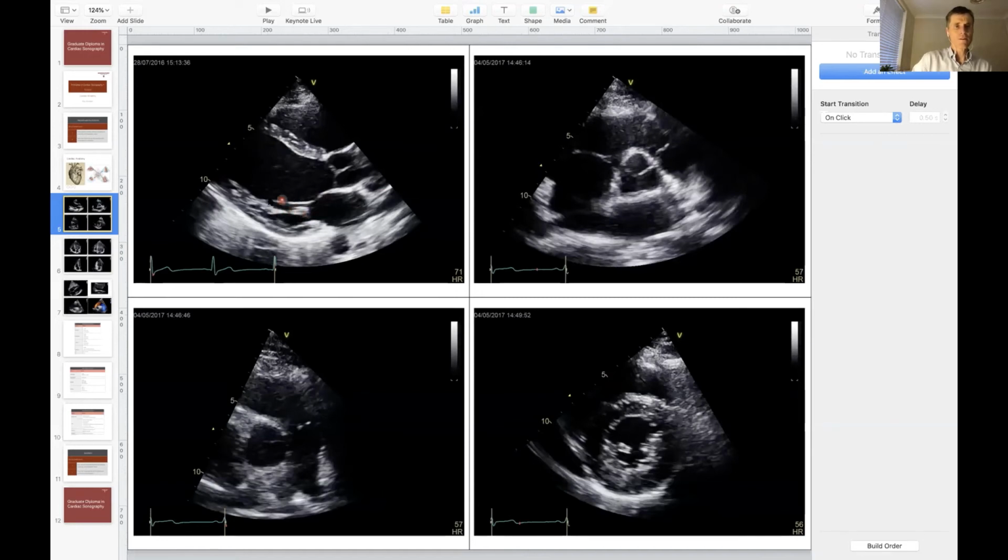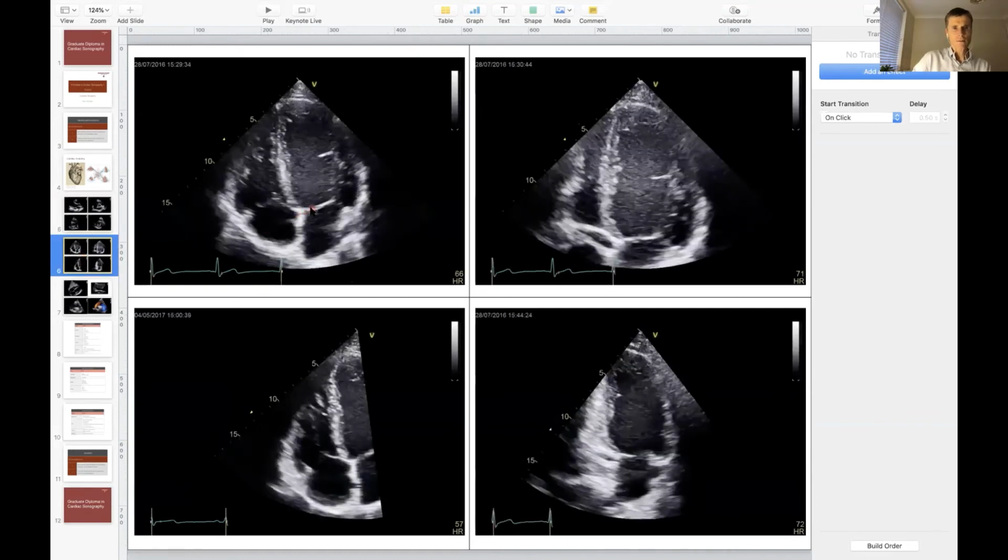You can see very clearly some of the chordae there that are almost certainly connecting to that posterior papillary muscle there. You can see pap muscles there, but not the mitral valve. You can certainly see the mitral valve in this apical four-chamber view, where we see the anterior and posterior leaflets again. And we see the mitral valve leaflet in this bottom right, probably the anterior leaflet there too.